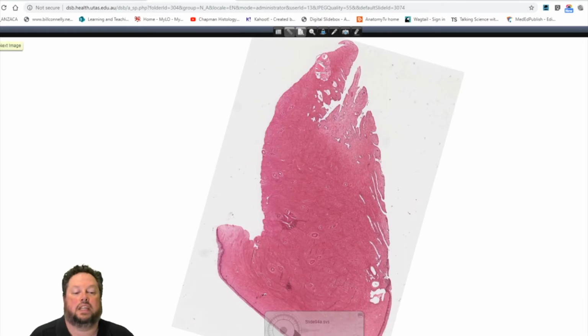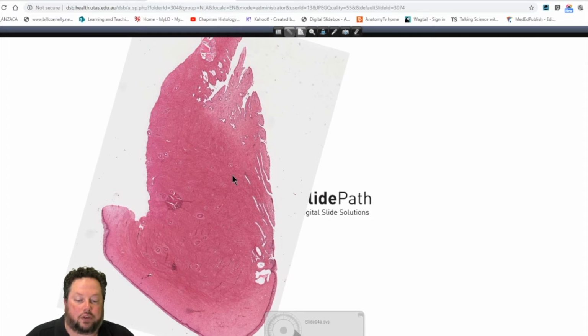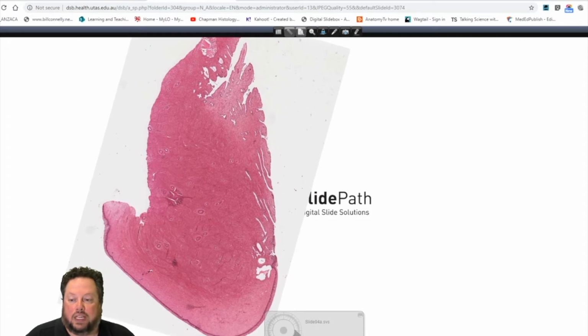Then the next part of the uterus is a little bit different, and that's the cervix. Now the cervix is really interesting. It goes through a number of changes during the lifespan of the person with the cervix, and it's very much driven by the hormones being produced by the ovarian cycle. So if we have a look here, this is an overview picture of the cervix.